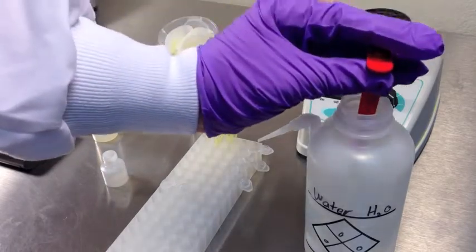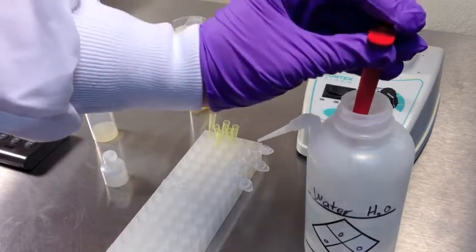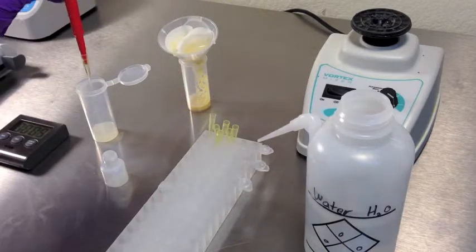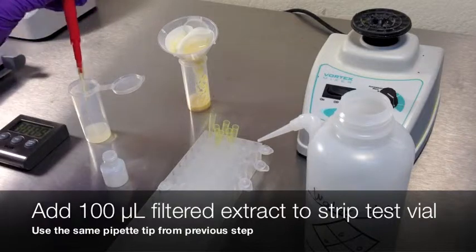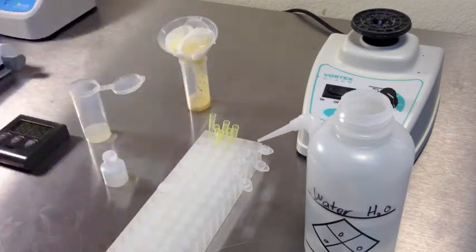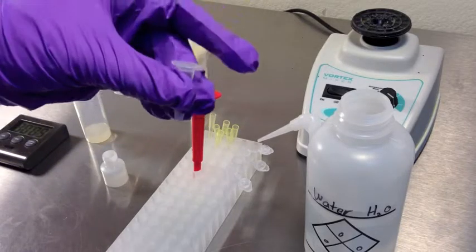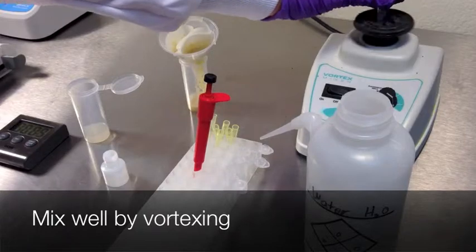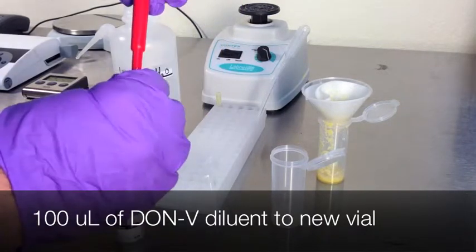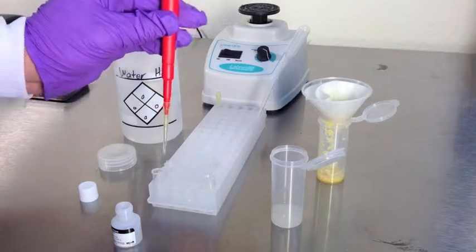Place a vial on the rack and add 200 microliters of purified water. Using the same pipette tip, add 100 microliters of extract into the vial and mix well by vortexing. Transfer 100 microliters of Don V Diluent to a new disposable strip test vial. Using the same pipette tip, transfer 100 microliters of diluted sample extract from the first vial, then mix well by vortexing.